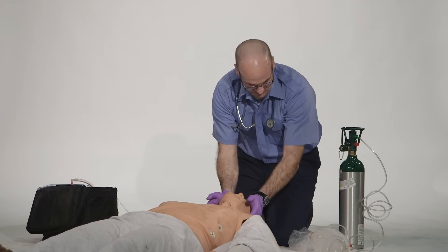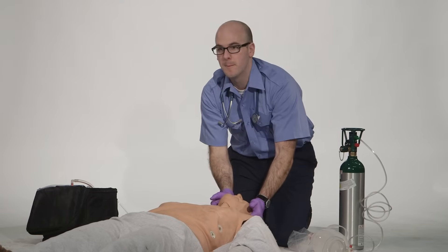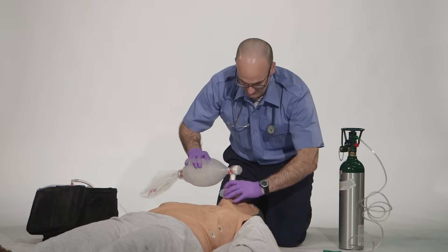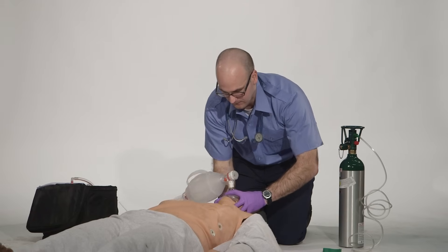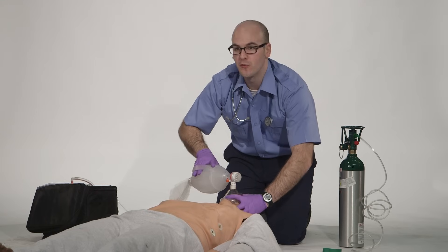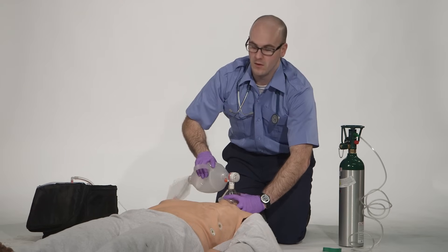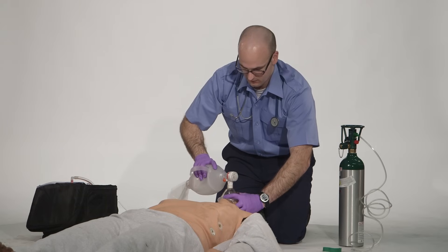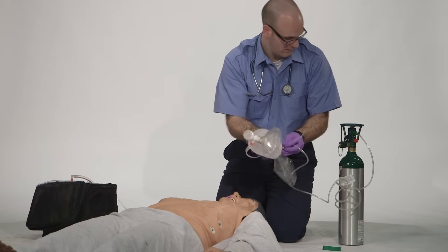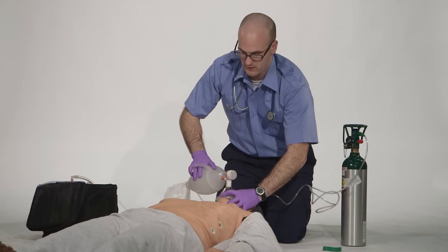Now I'm going to open the airway manually again and insert an OPA. Does the patient accept the OPA? No gag reflex is present. Now I will begin ventilating my patient with the BVM at a rate of 10 to 12 breaths per minute. I'm going to recheck to see if I have a carotid pulse. Do I still have a carotid pulse? You still have a carotid pulse and the breaths are going in without difficulty. At this point I will attach my BVM to high-flow O2, get that attached, turn my regulator on, and continue ventilating my patient.